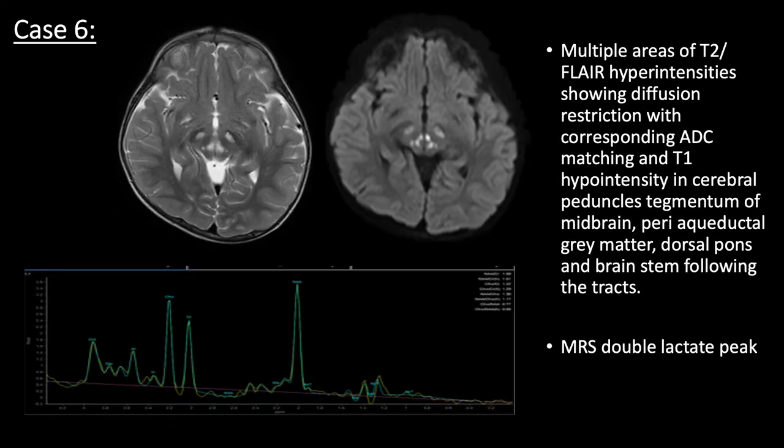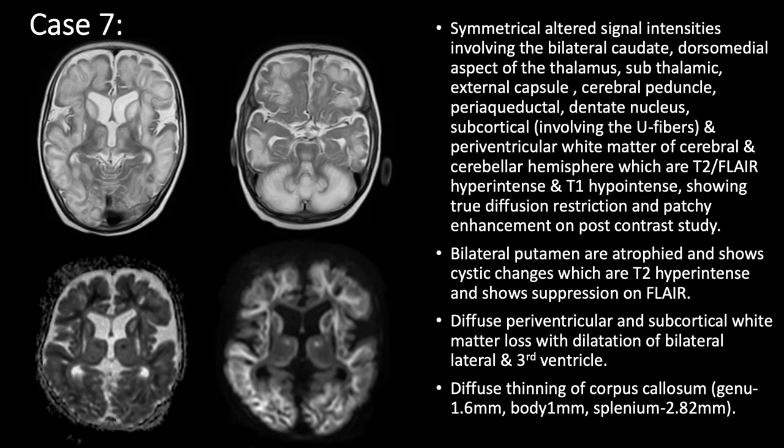This is a case of a 2-year-old patient, which shows T2 FLAIR hyperintensities in bilateral periaqueductal gray matter, dorsal pons, and the tracts of brain stem. MRS shows double lactate peak on the lesions.